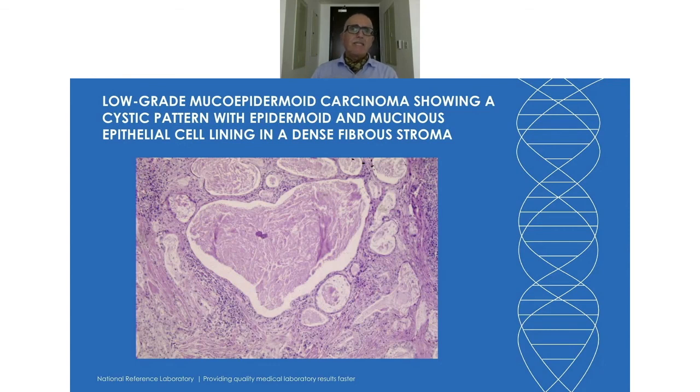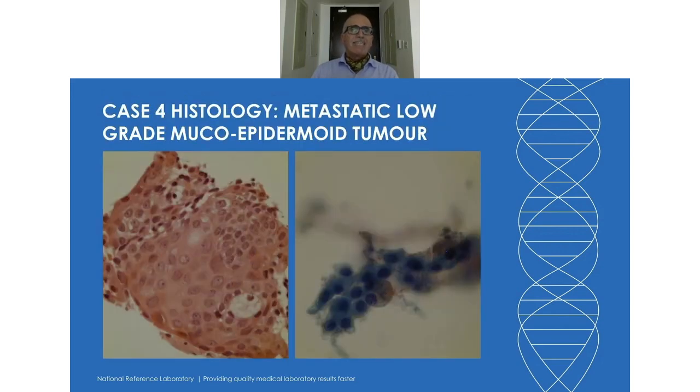It can be cystic, so if the needle goes in here, the cyst can be much bigger as well. Then you have this debris with not that many cells, or so few that you find it difficult to make up your mind. And this is the actual histology of this case, showing both the squamous cells as well as the mucin-secreting cells. So this was the last slide.